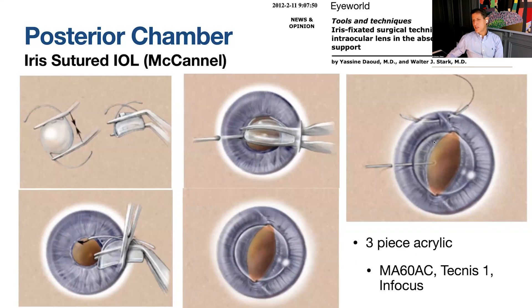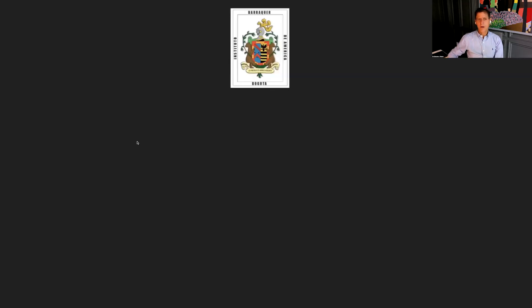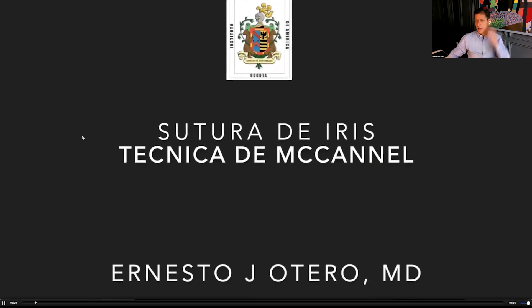We can see the haptics through the iris, then pass a prolene suture underneath, capturing the haptics with the iris. In McCannel's original technique, a scleral incision was made to exteriorize and tie the suture; we can perform a modified Siepser knot in the anterior chamber instead. This video was taken in the Flying Eye Hospital during an Orbis program in Panama.